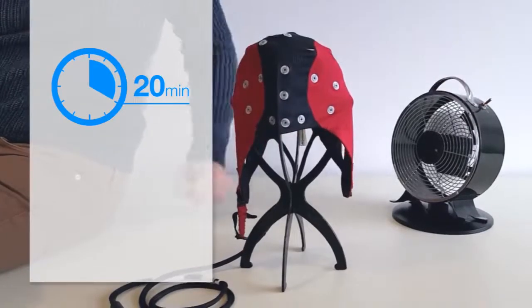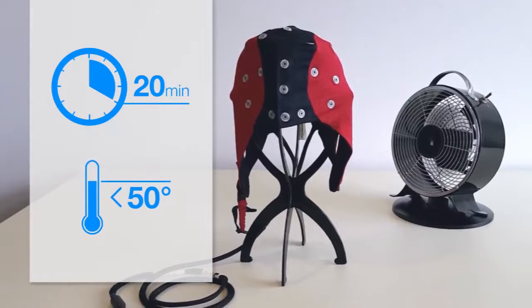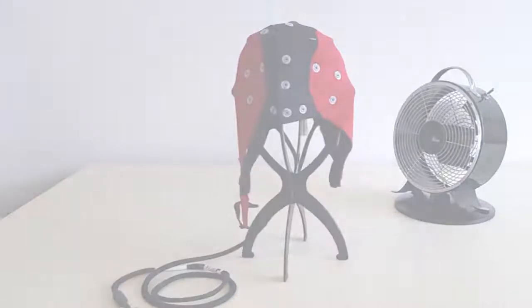Please make sure that the cap is no longer dripping wet. Avoid drying the cap in hot environments exceeding 50 degrees Celsius, as hot air drying may significantly reduce the lifetime of the cap.